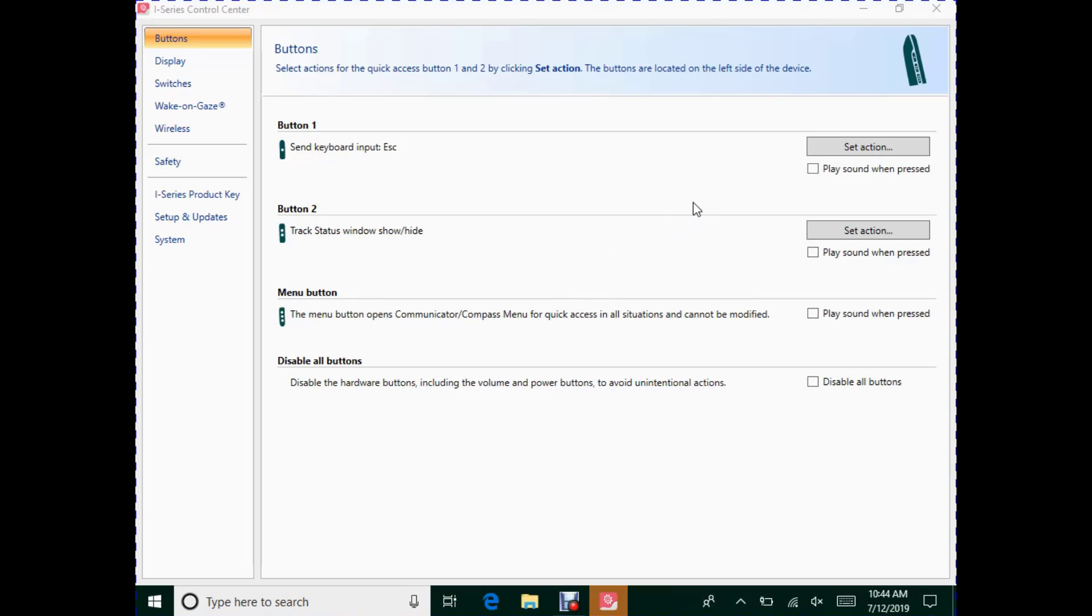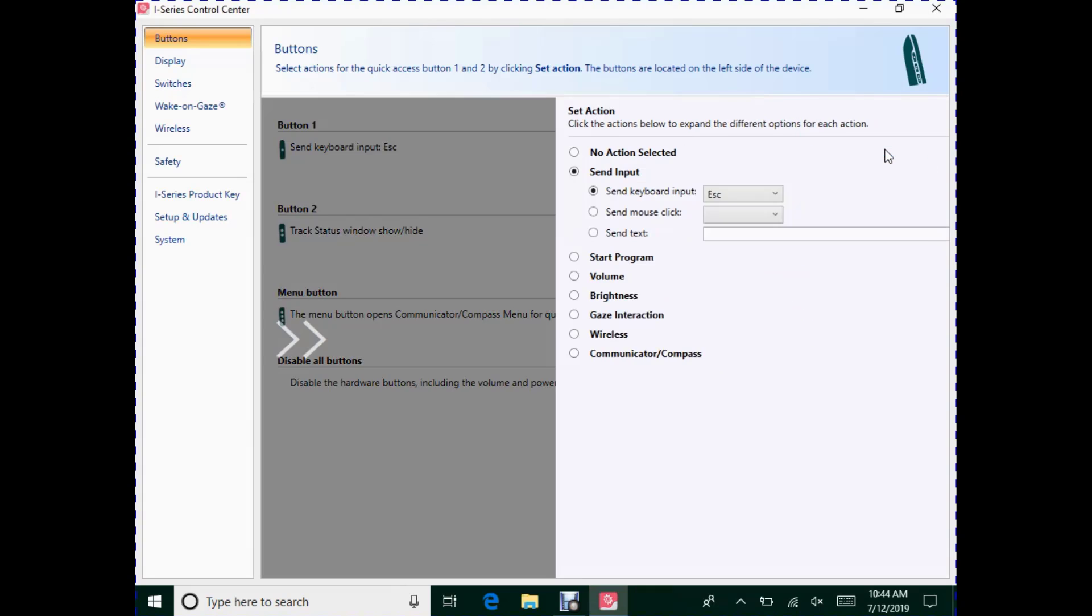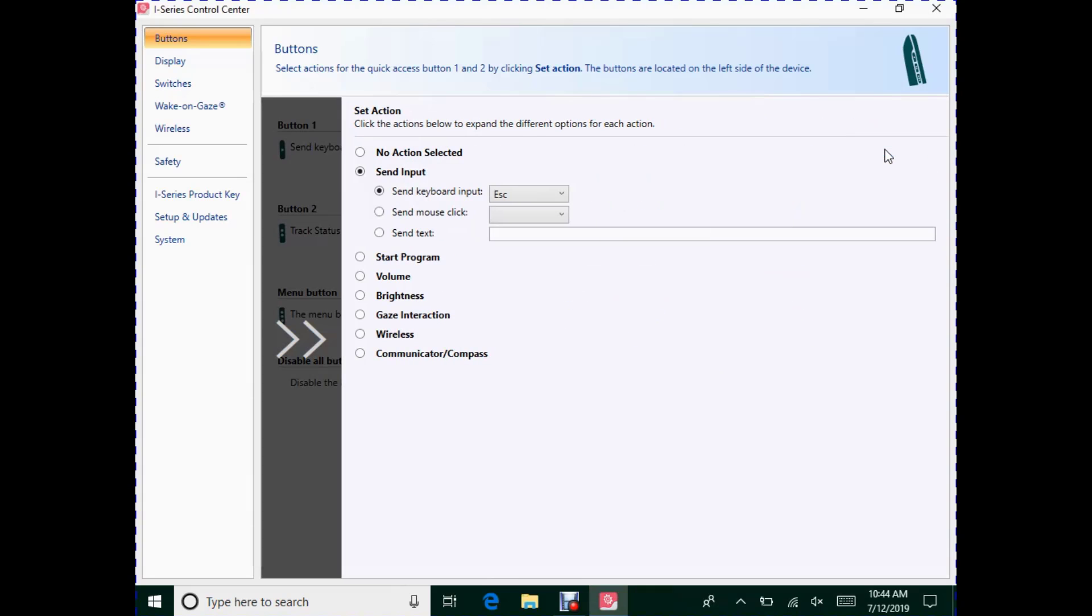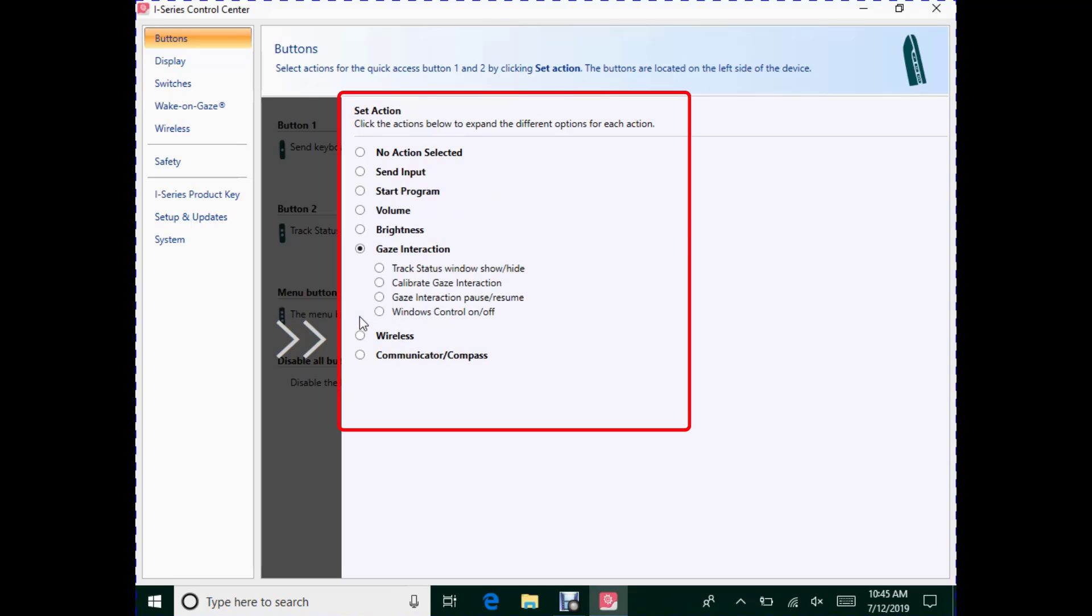To set an action for a button, hit the Set Action button and select the action that you want. The most used is Gaze Interaction. Under Gaze Interaction, you will see the Track Status window, Show and Hide.